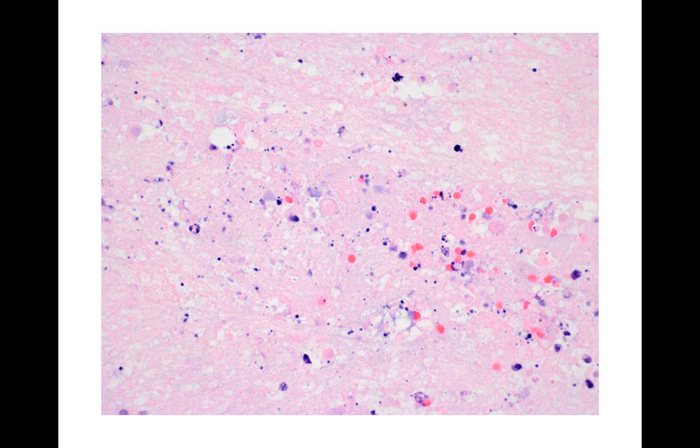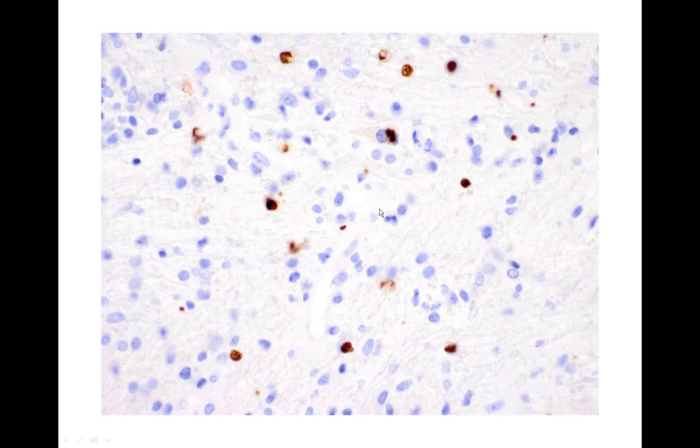So I was able to do then a special stain. It takes like an overnight to get the stain. And the details are not important. The bottom line is that with this stain, anything you see that's brown is toxoplasma parasite. Anything that's not brown are the patient's own cells. And again, this is not the kind of stain you can do rapidly. You can't do that in the operating room. It takes like 12 hours or longer to get it done.